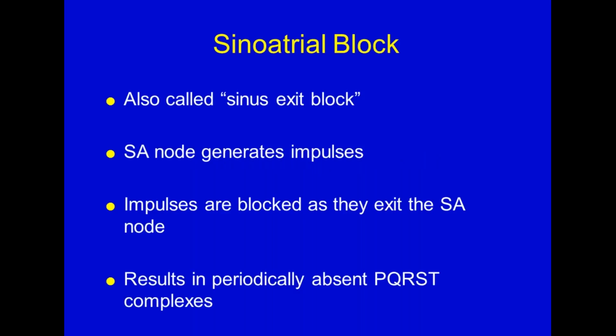Very rarely. Sometimes you'll see it if you watch the monitor. I've seen it with some elderly while somebody else is listening to their lungs and having them take a deep breath. You'll see that deep breath, you'll see the slow down, and then they exhale. But not really very often. The SA block.